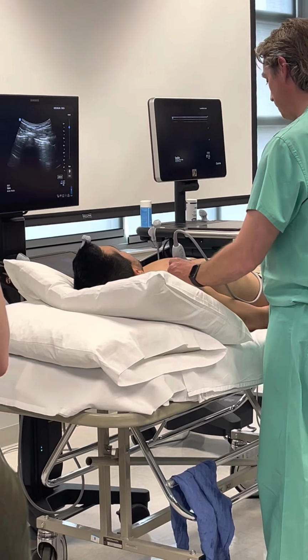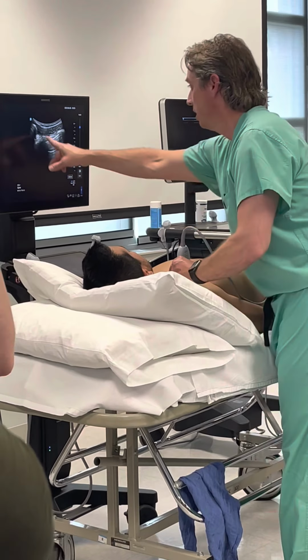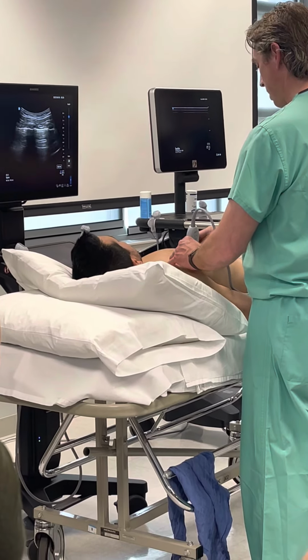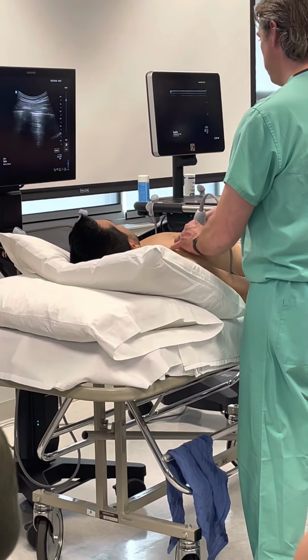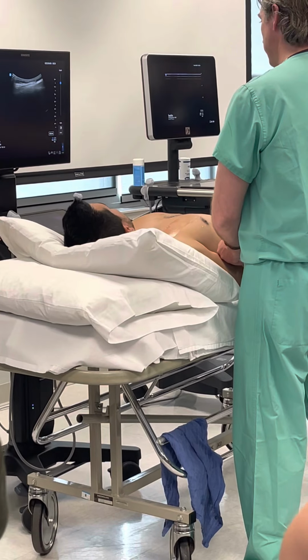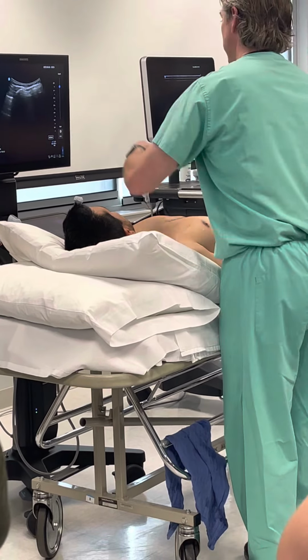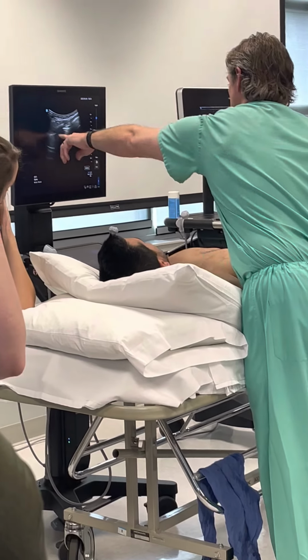So when you're assessing your lungs, you always start up here at the ribs, so I can see clavicle, rib 2, rib 3. We're going to systematically walk down all of those ribs, and we're going to look in between. I'm not just moving straight parasagittally down his chest wall. I'm actually going to be falling off to the side, because eventually I want to get down here and look on the side and see, okay, I see this normal lung here. I don't see anything down below there. But instead, let's look at your lung right here. So you can see lung as he breathes in and out.